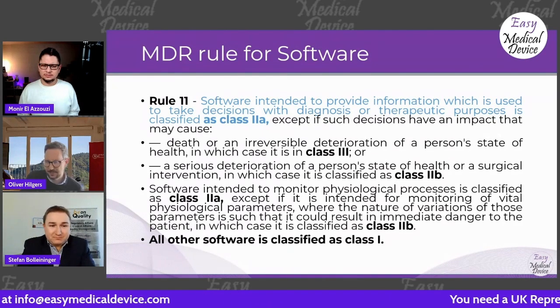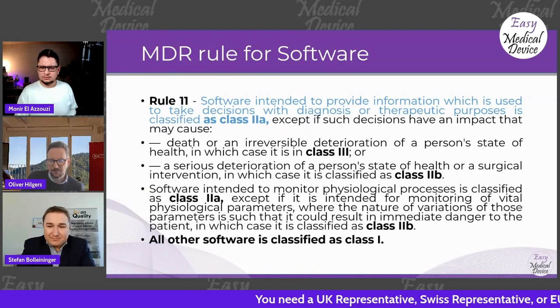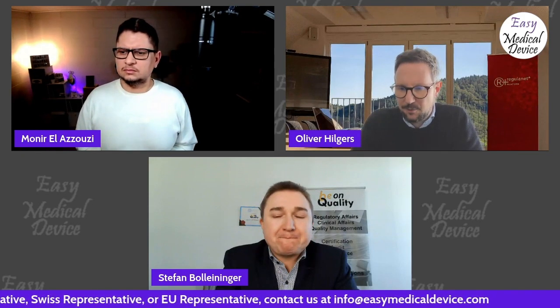Okay, yeah. Oliver? Yeah, I agree. So it's really about, if you look at the definitions of diagnosis, it usually includes a healthcare professional. You need this type of expert to really take this decision. So as long as you have software that is rather focusing on the patient, it doesn't necessarily mean that the healthcare professional is always excluded in your software.